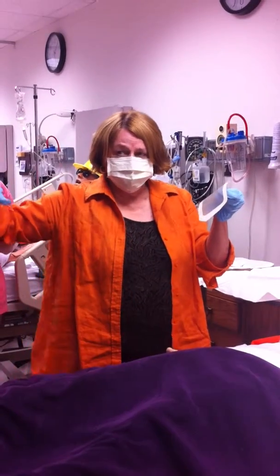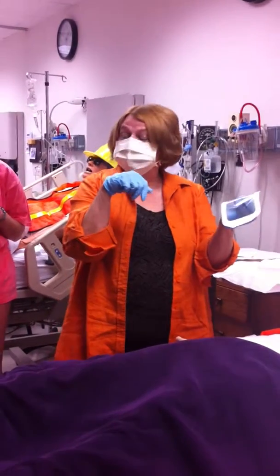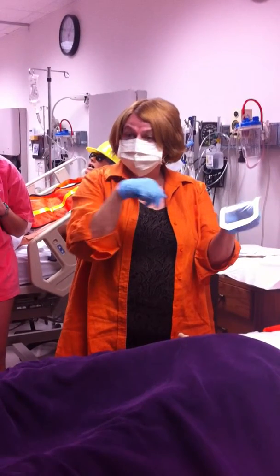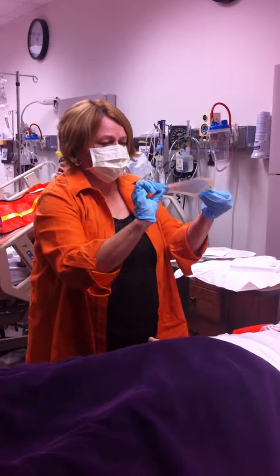If I put my trash can here, I do not run the risk of moving something that is dirty or soiled over my sterile field. Can't do it. That's what I mean, setting yourself up for success.